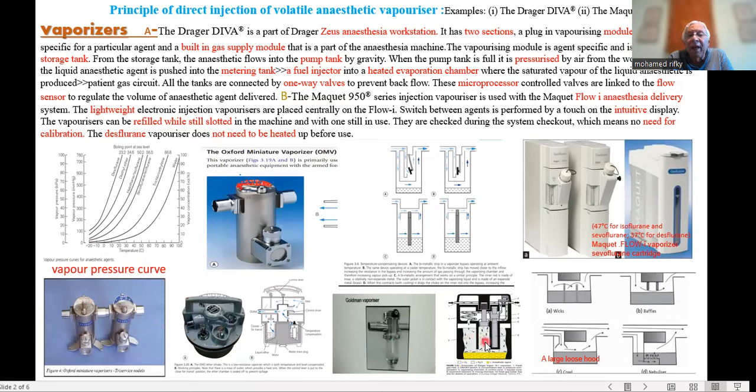And this is the normal contemporary vaporizer, and this picture will show the thermal compensation, and these are the direct injectors, and these are also a compensator for increasing the surface of the vaporization area. This one is called cowl. Cowl means a hood. We will explain: a cowl looks like a hood worn by monks.